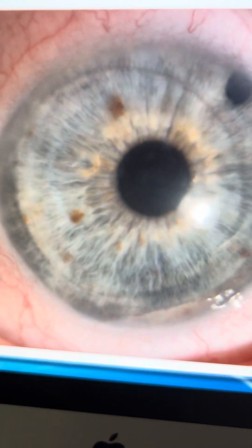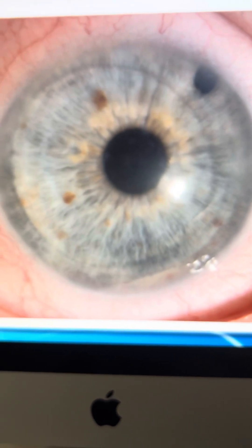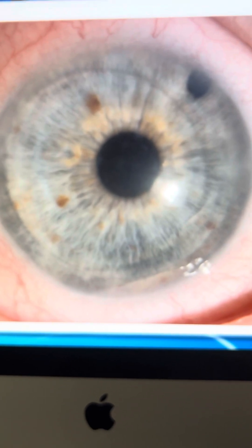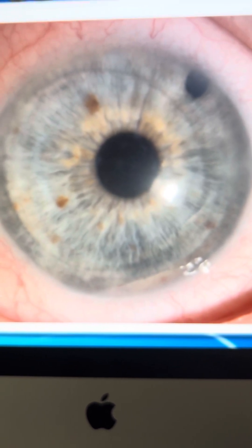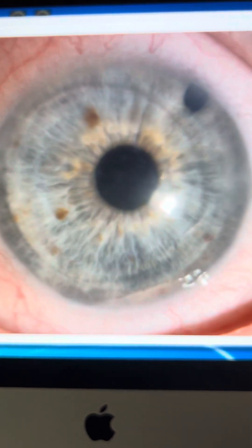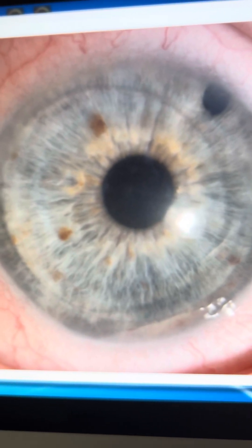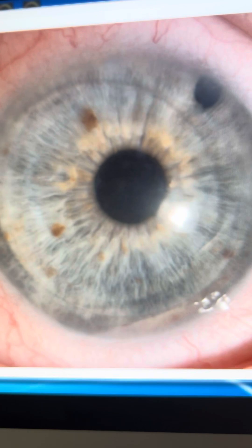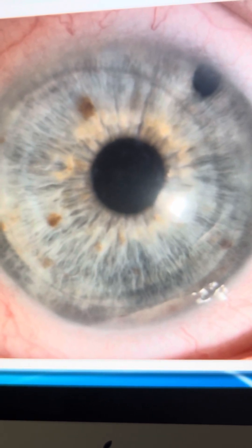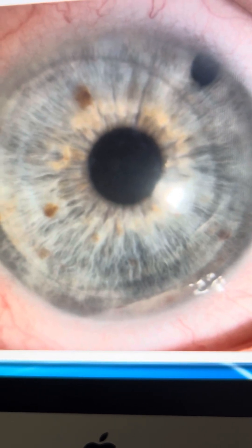We reach the point today to enjoy uncorrected vision of 20/25 with the toric IOL. This is really the work of a whole team. We want to thank the Seattle team for sending us such an impeccable DSAEK graft, and all the attention we gave to removing the cataract and retaining an intact capsule bag, despite using close to 600 joules of energy. Through my standard 135-degree incision, we put a toric lens and addressed toricity. Nothing makes me happier than seeing a fellow physician enjoying good vision — she's ready to hop on a boat in August, go to her island, and enjoy her summer with her kids and grandchildren. That is what we work for. Thank you very much for your attention.